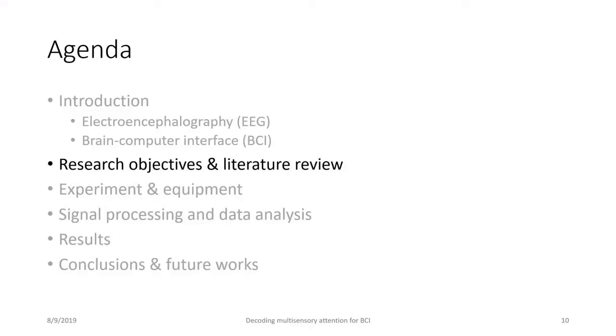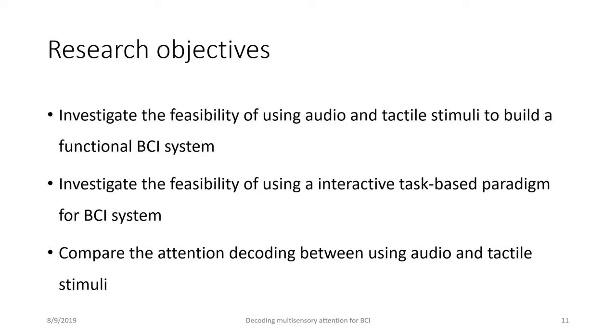As I said, one of my research objectives is to use audio or tactile stimuli to build a BCI system that is functional. Also, a lot of the paradigms that I introduced use steady state responses, which means you play, for example, an auditory stimulus at a certain frequency, which is a pure tone, and you just passively sit there and try to pay attention to that. I think maybe there are some better ways. For example, if we can integrate an interactive, task-based paradigm into the BCI system and see how the increased engagement of subjects could help the BCI decode our brain signal.